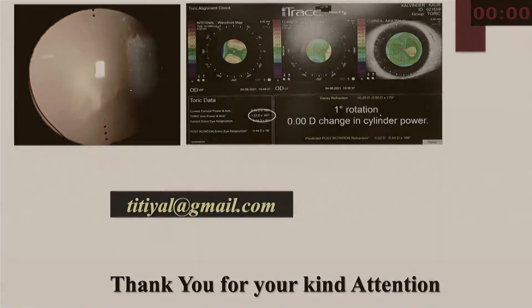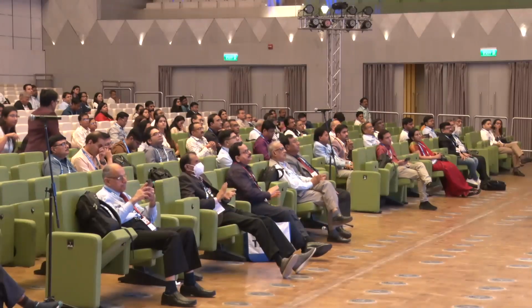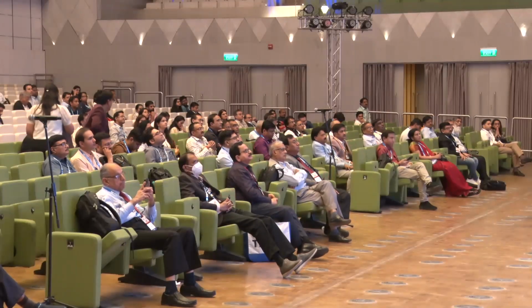Thank you, Dr. Titiyal, for that wonderful exposition of the entire array of toric intraocular lenses. My go-to formula for my basic IOL power calculation is the Barrett toric calculator, because straight away upfront I want to know whether toric is indicated or not, and it takes into consideration the posterior corneal astigmatism. It's not universal, but the toric calculator.